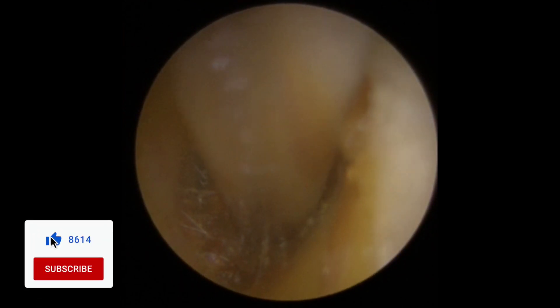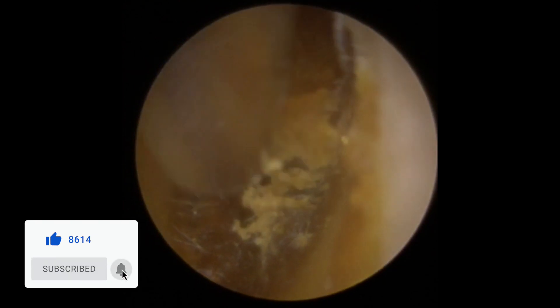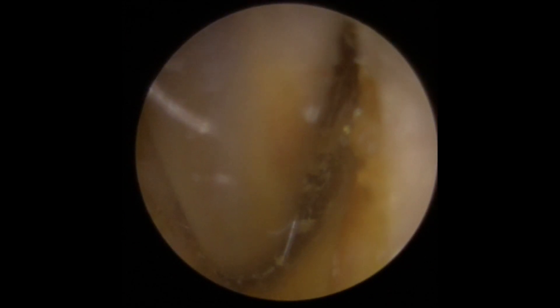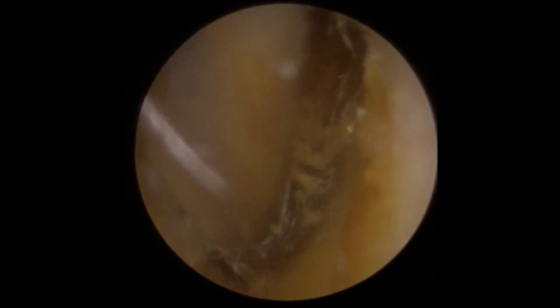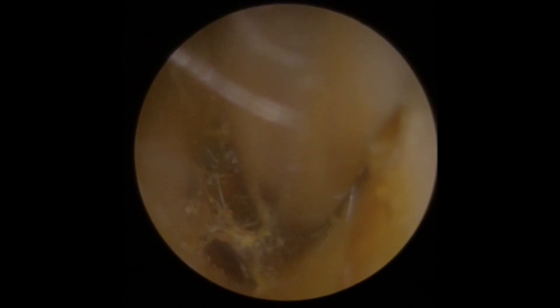If we try to pull the central section of wax away, what would happen is as we got a grip on that, this section attached to the right-hand side canal wall would hold everything in place. So we really need to get this away first, but you can see it's quite delicate and painstaking work. You can see it's starting to loosen a little bit at the bottom, and now the right-hand side is starting to come away.